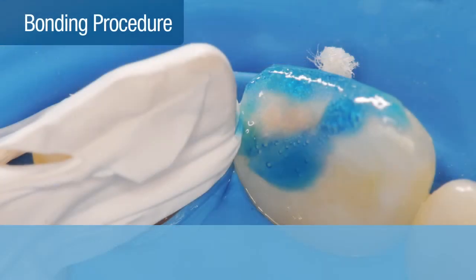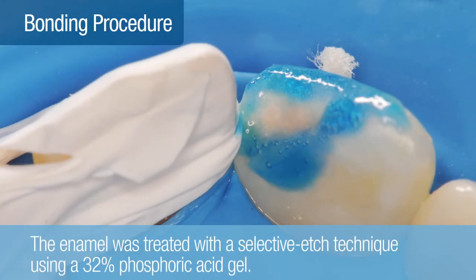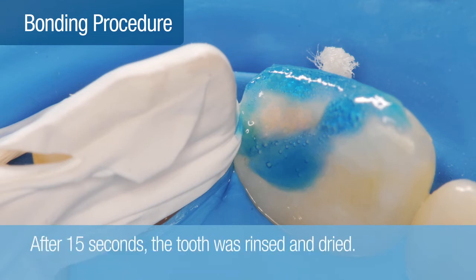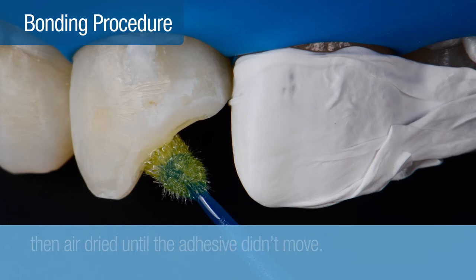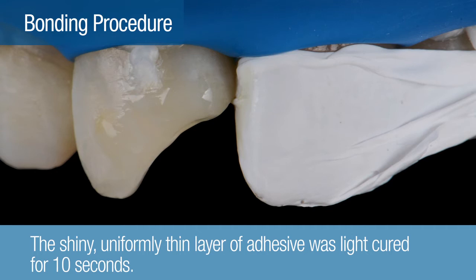To start the bonding procedure, the enamel was treated with the selective etch technique using 32% phosphoric acid gel. After 15 seconds, the tooth was thoroughly rinsed and gently dried. Scotch Bond Universal Adhesive was applied to the tooth with a rubbing motion for 20 seconds, then air dried until the adhesive did not move under the force of a gentle stream of air. After a shiny, uniformly thin layer of adhesive was observed, the adhesive was light-cured for 10 seconds.